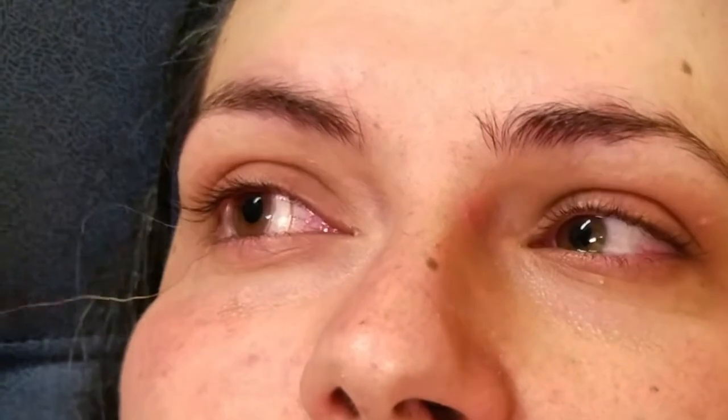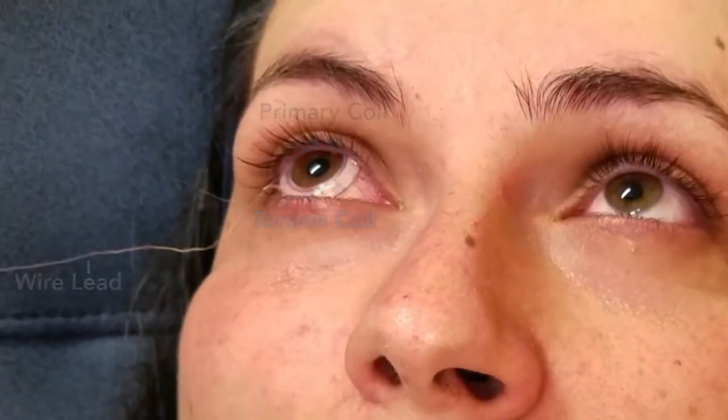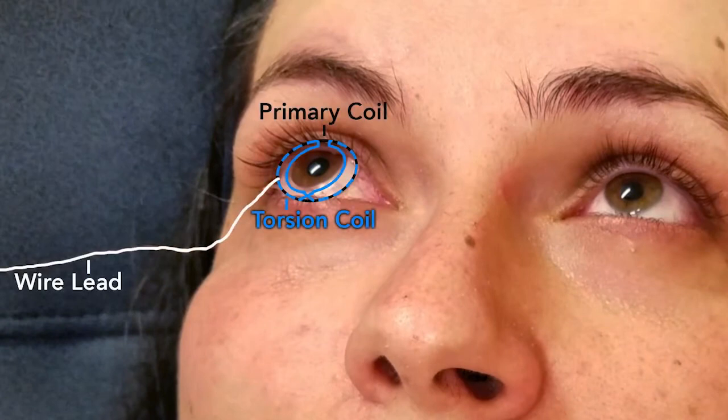Today, the gold standard for eye tracking is magnetic tracking using scleral search coils. The user wears a contact containing a wire loop and sits within a magnetic field generated by large coils, often several meters across.